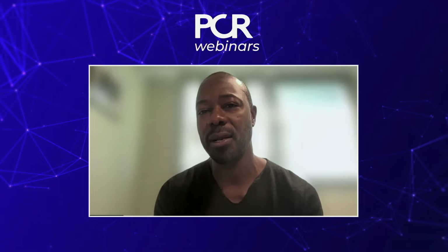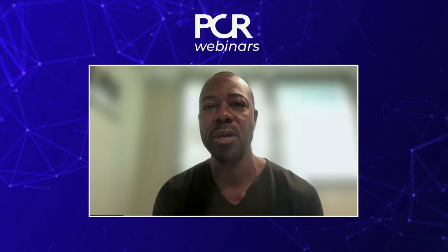Absolutely. Mike used the Evolut FX. But in the upcoming months, we will have even the FX Plus with a greater likelihood of easy cannulation of the coronary arteries. So that is very reassuring.